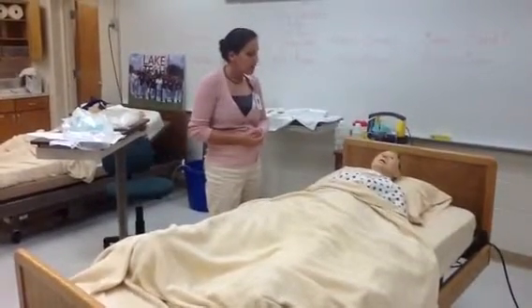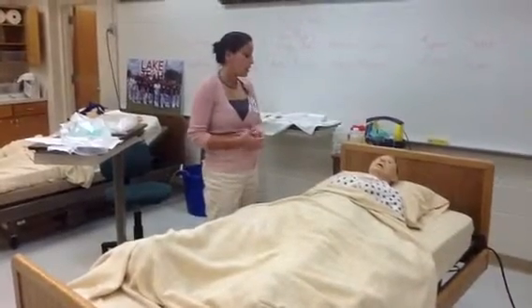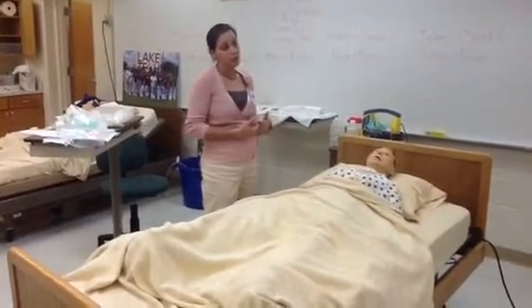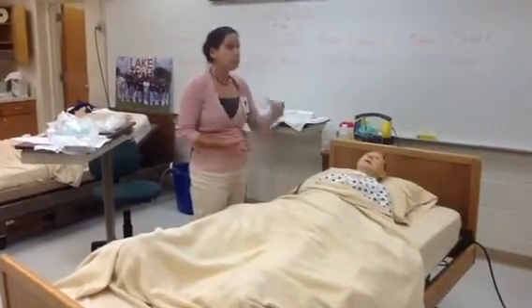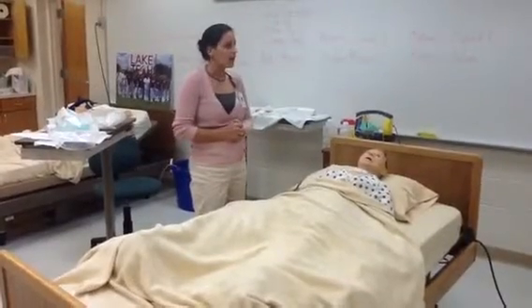Now if you are having any discomfort, please call me. I'll be in frequently to check your output and empty your bag. When you need to get out of bed, please call me because I don't want you to trip on this catheter. Call lights within reach. Make sure that there are no other questions, and then I can go.